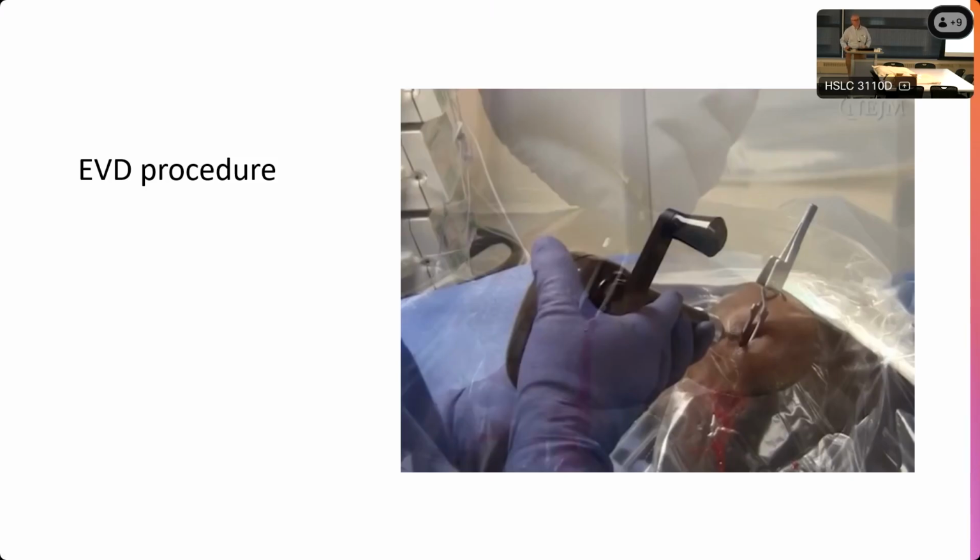The last turn, it's a cortical bone on the inside, and then it feels in many ways harder to turn the drill. At that point, I don't keep pushing forward. I'll keep a neutral position or pull back when the bone catches, and then drill a little bit more to make sure it's cleared out.